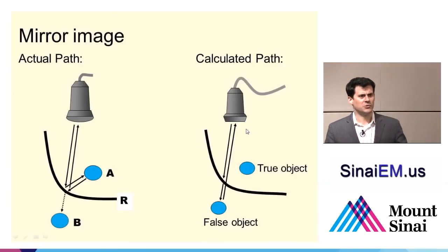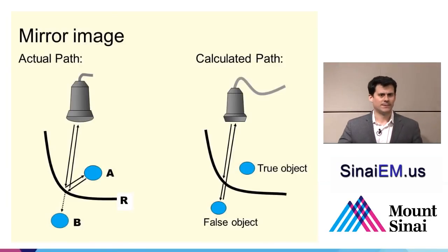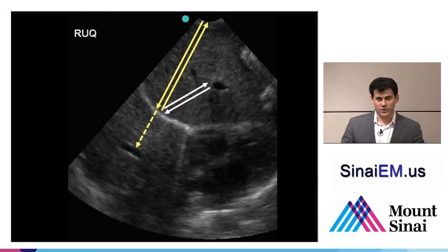So if you look in any ultrasound textbook and you look up mirror image artifact, probably 95% of the time there's going to be a picture of a diaphragm and a liver, just like we've demonstrated here. And there's going to be a circle above the diaphragm and a circle below the diaphragm, just like we've demonstrated here. And it's almost always a cancer. And while I don't not care about cancer, it's not my primary focus in the emergency department, nor is it often in the ICU or other point-of-care applications to find cancers. But we often want to check to make sure that there is fluid above the diaphragm.